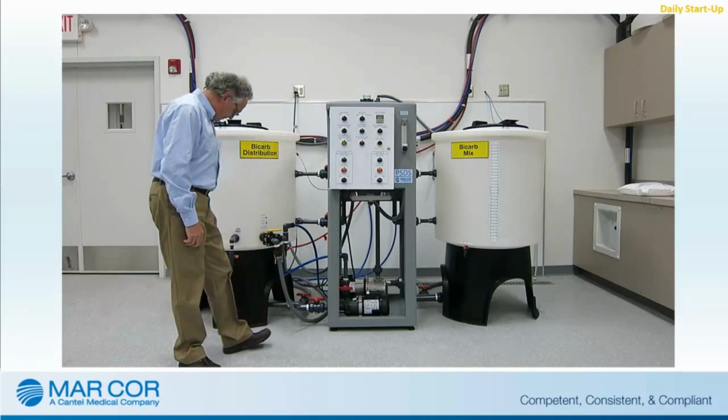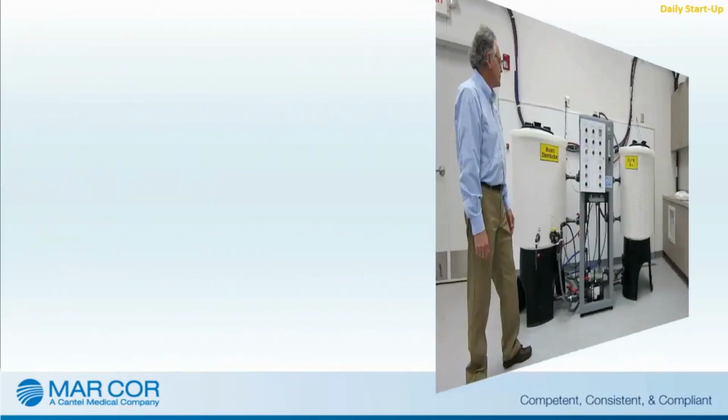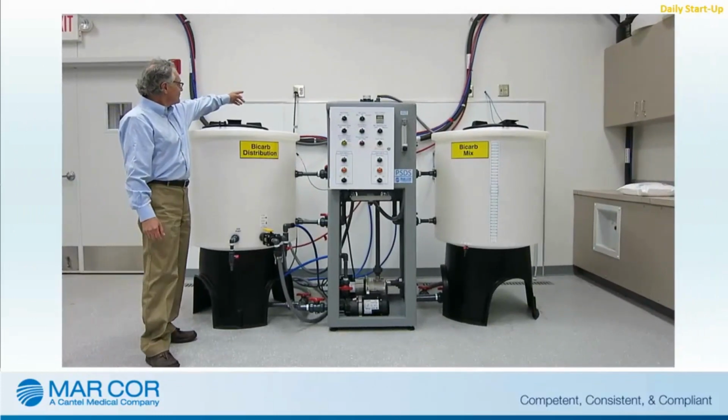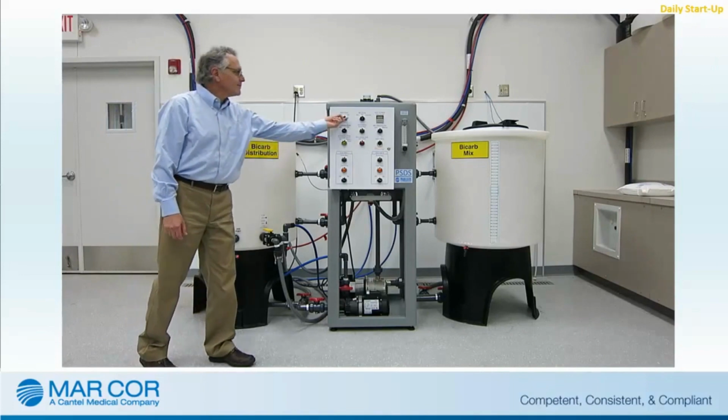Daily startup will include ensuring that the various water valves are in their correct positions, that there is power to the PSDS, and that the main power switch on the PSDS is on.